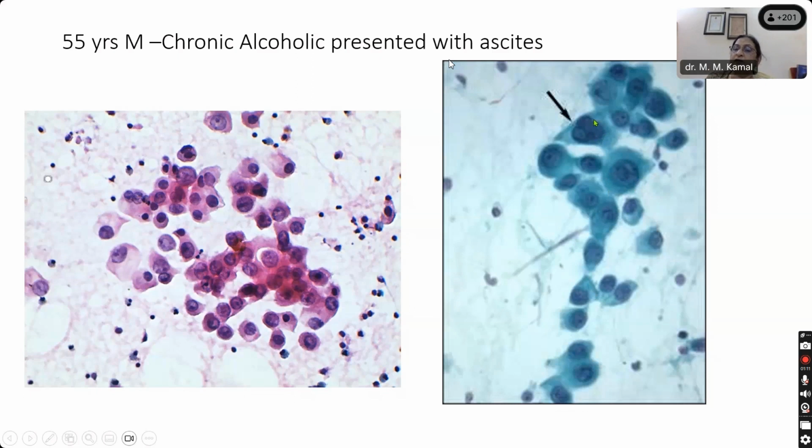It's not very bad. We know that there is multinucleation and hyperchromasia in reactive mesothelial cells. So you thought that there was some atypia over here. Is there any difference between the appearance of cells in both these pictures? These look a little more bad than these, or both are same? Ma'am, almost the same. Yes, so they both are same. There is some amount of atypia. Now, would you like to put this atypia as favoring malignancy or favoring a reactive process? Ma'am, I would like to put it under favoring a reactive process. Yes. So that is one thing.